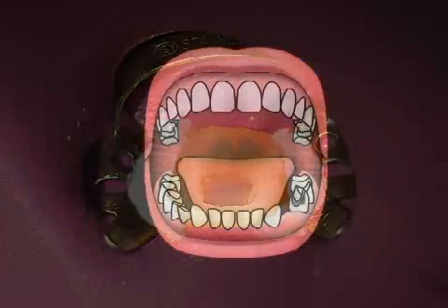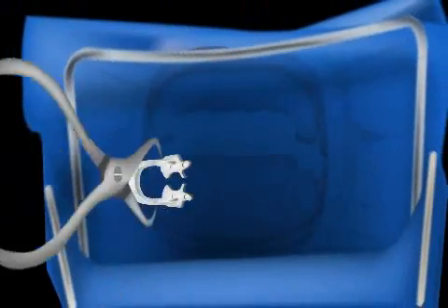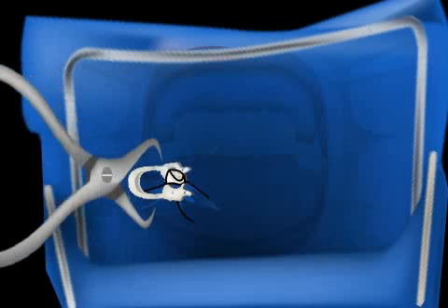Furthermore, any swallowing or breathing in — referred to as aspirating — of instruments or foreign objects is prevented thanks to the presence of the dental dam.